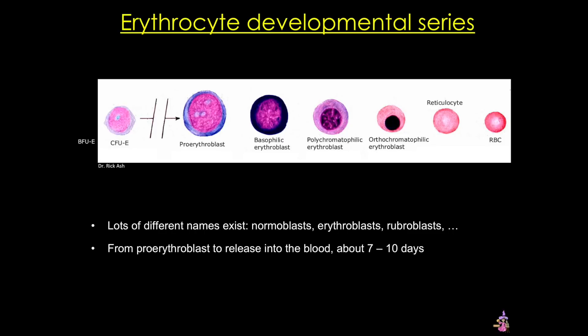Now let's take a look at a couple of the lineages where it is reasonably easy to identify the stages. Remember, this is a continuum, so not every stage will have a name, but there are specific stages that have consistent characteristics and that's what we'll focus on. We'll start with the erythrocyte or red blood cell lineage. This lineage makes erythrocytes or red blood cells, which are also called all sorts of different names — from normoblast, which tends to be a pathologist term, to erythrocytes or red blood cells. Here we're looking at a developmental series from left to right with the mature red blood cell farthest to the right. From pro-erythroblast to release into the blood takes about a week.